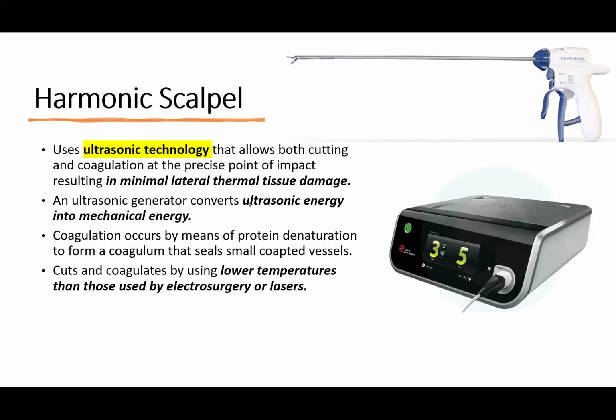And very interesting about all these devices, they are simple to use. They have automatic settings. You just plug and apply. Once you plug in the handle, okay, it will just auto set. There are some settings you will see, maximum 5, minimum. Okay, we'll come to that later when dealing with it practically, but they are very easy to use.